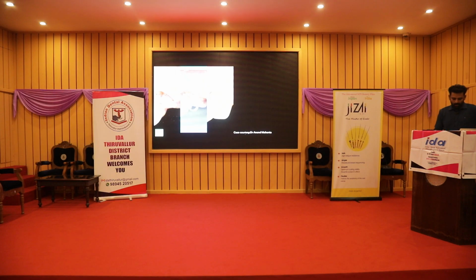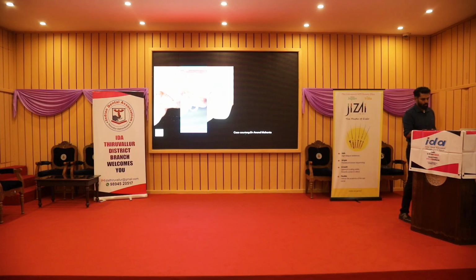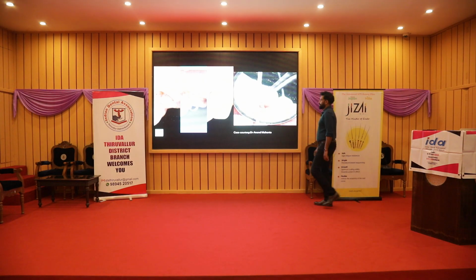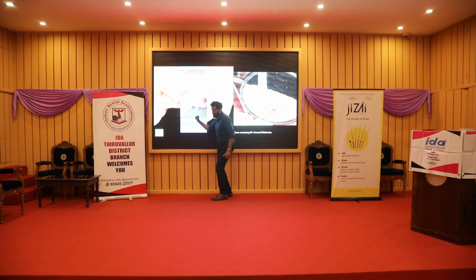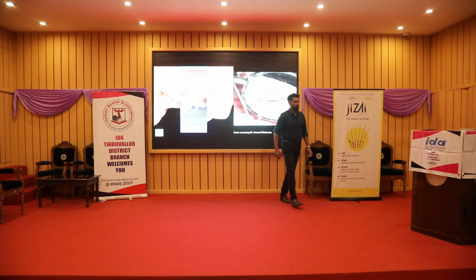This is another case where, with the ferrule structure, there are chances of violating the biological width. You should preserve the biological width, right? So in this case, gingivectomy is not possible. In such cases, you can do something called an extrusion. You see here there is no ferrule structure, so orthodontically it was extruded, and then the post was placed, and then the core structure was built.